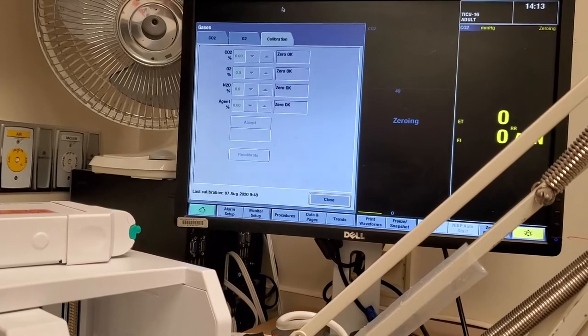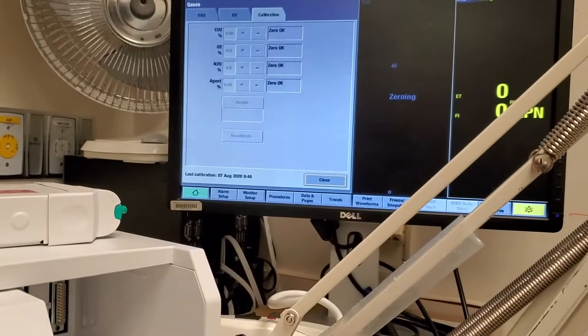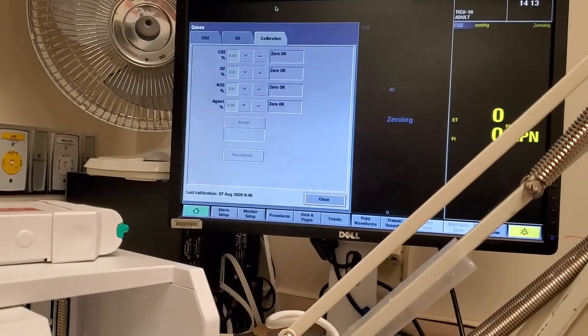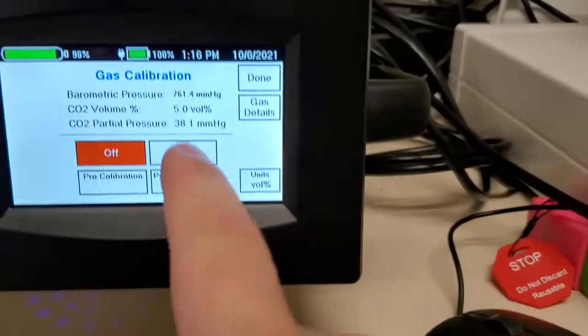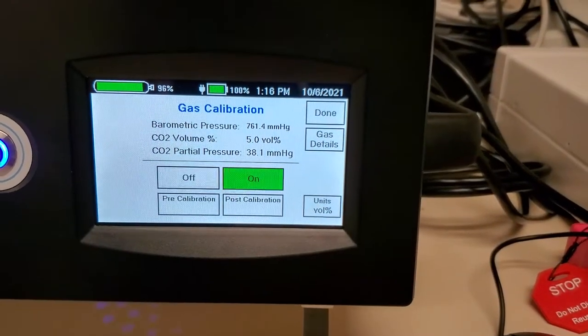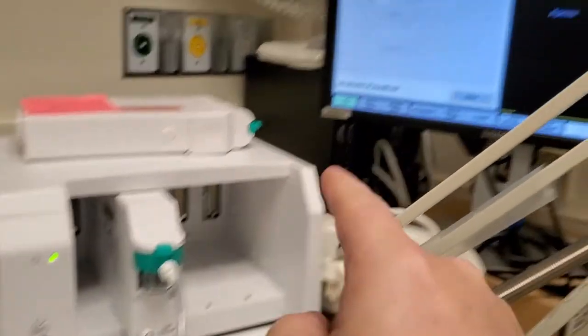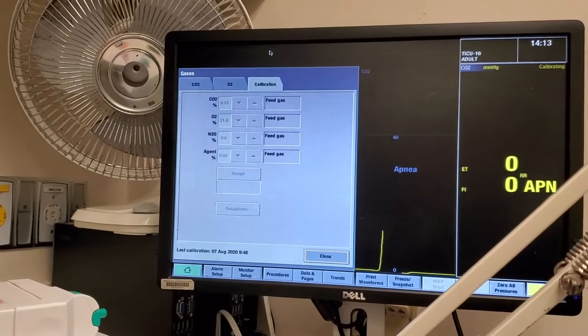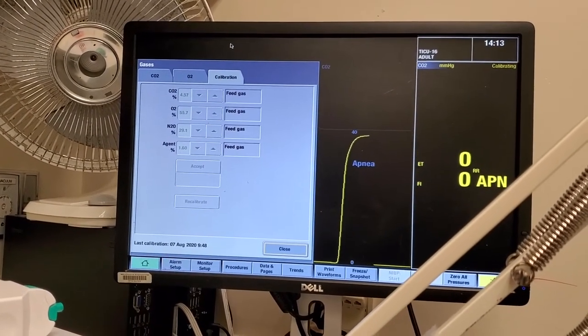We're going to let it zero out. Now, if you have not waited five minutes, it'll tell you that you have a warm-up period that you have to wait through, but it's already warmed up. Next it's going to say 'feed gas' — that's when we come over here and press on. It activates and slowly bleeds off the tank into the module. There's your waveform showing the gas coming in.